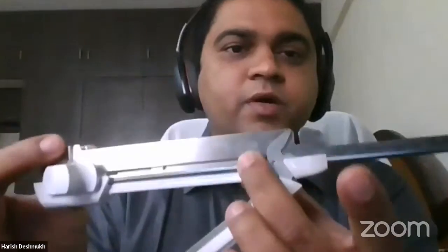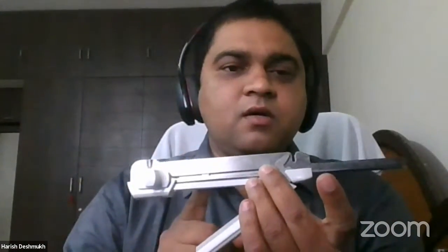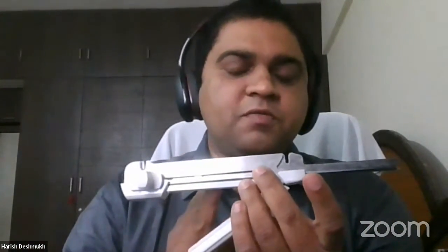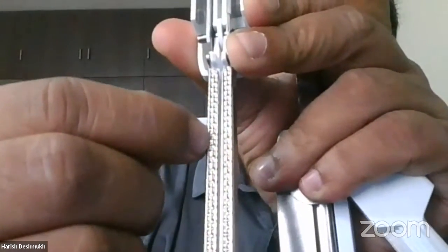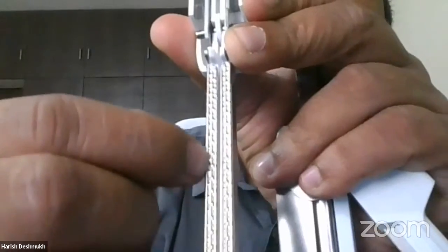When we talk about the stapler, there are basically three components. One is the cartridge, which we call the reload. Then we have the stapler's two arms when it comes to the linear cutter. One is called the cartridge half, where we put the reload. The second half is called the anvil half. This is the place where the staple goes in and forms the B shape. These are called anvil grooves.